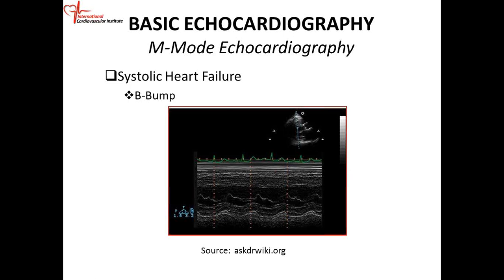But you're going to go through, the septum may be a little bit thickened, the posterior wall may be a little bit thickened, but look at your points, okay? So we have our E point, F point, A point, and then we have this little bump right there.